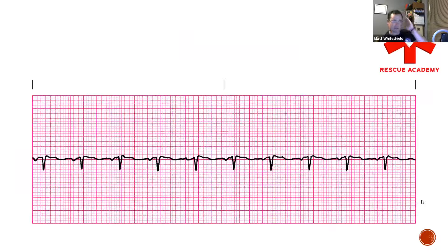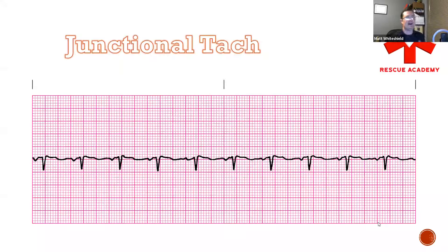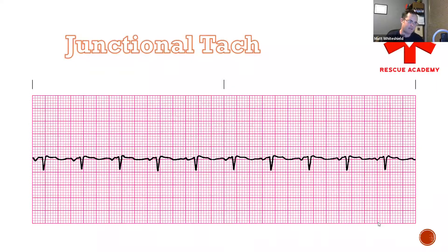Let's take a look at this one. We got inverted P-waves. We have a rate — counting up to 10 R-waves, a rate of 100. This is where things get a little finicky. Remember, anything greater than 100 would be considered junctional tach; anything less than 100 but greater than 60 is considered accelerated. This is junctional tach because there's a beat right here at the end — it's pretty close — so this rate is just over 100.